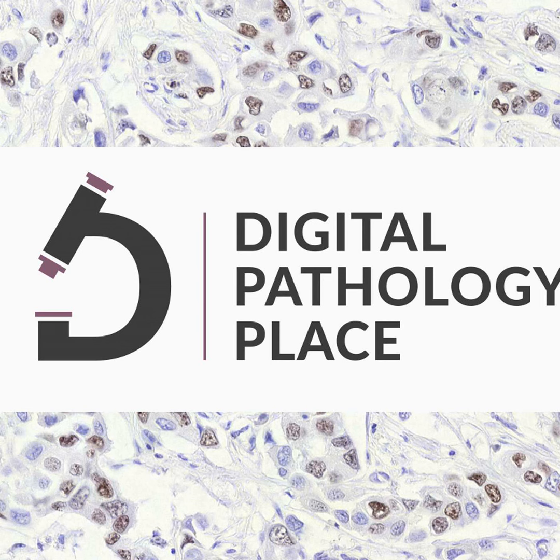Even if you have the most generalizable model on the planet, if there is data from outside your cohort, there is no guarantee it's going to be the same type of data, right? And you trained an algorithm or model on a certain type of data. So what can we do to make sure that your algorithm is even an appropriate tool for the new data that's coming in? And this is what those researchers did. They developed TrueCam, a framework designed to ensure both data and model trustworthiness in non-small cell lung cancer subtyping with whole slide images. Non-small cell lung cancer was basically their use case. You can probably do it for anything.